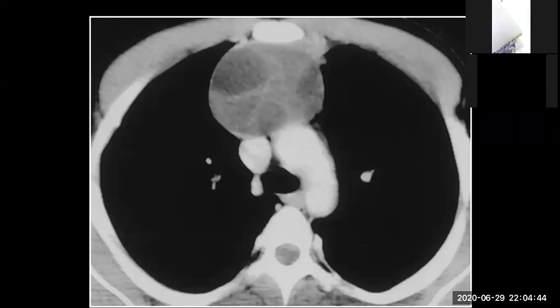It looks like cystic, okay. So, what else? يعني ال multilobulated. Okay, فيها multiple cystic lesions. Multiple cystic lesions in that mass.